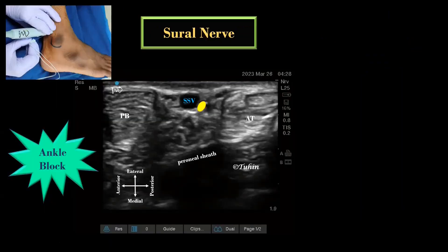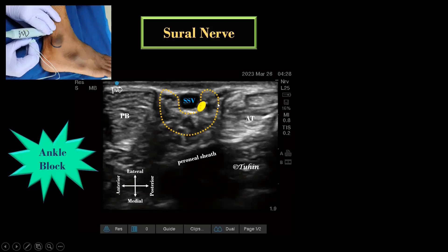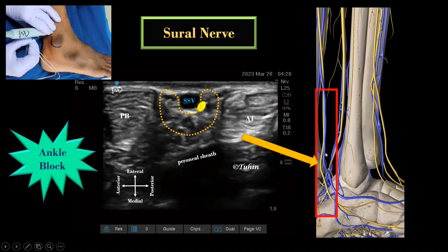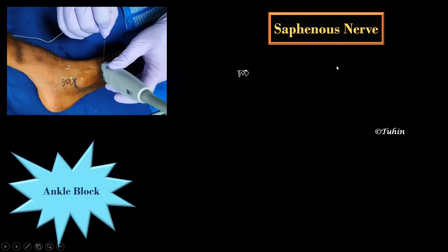For sural nerve block, the transducer is placed across the space between the posterior border of the lateral malleolus and the Achilles tendon. The sural nerve lies next to the small saphenous vein and superficial to the deep fascia, appearing as a hyperechoic oval structure adjacent to the lesser saphenous vein. If not clearly visible, scan proximally and distally. Anatomically, it lies anterolateral or posteromedial to the small saphenous vein depending on the level of scanning.